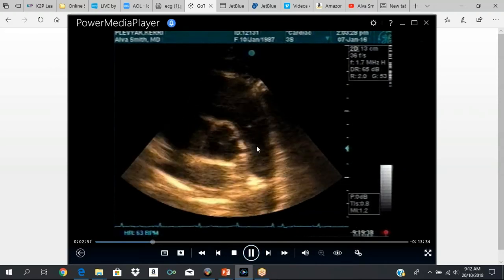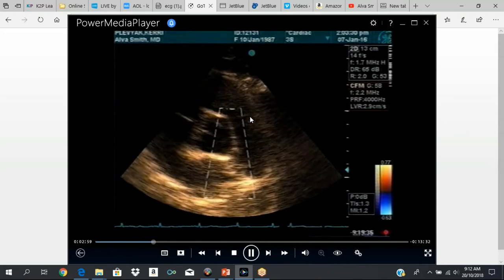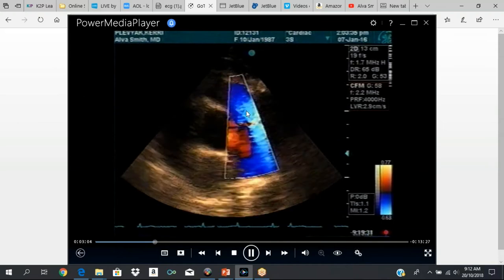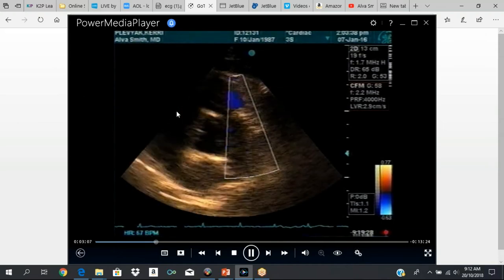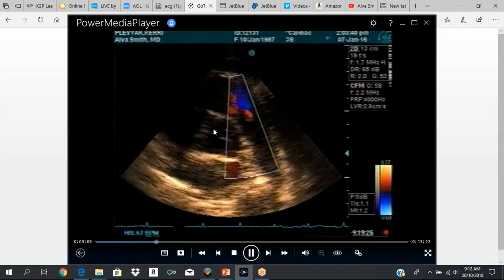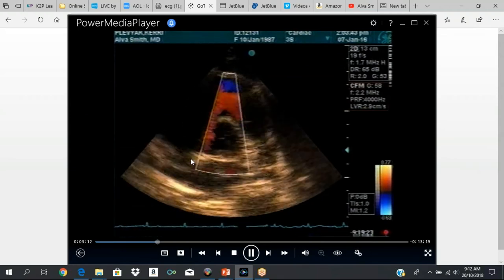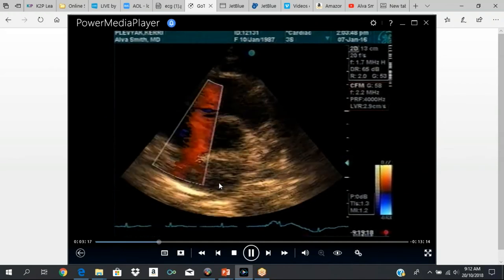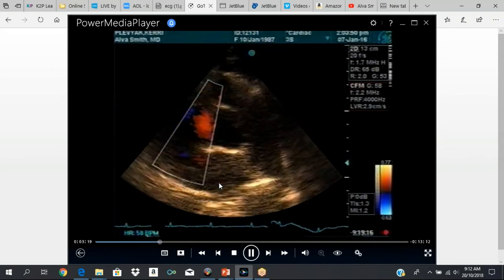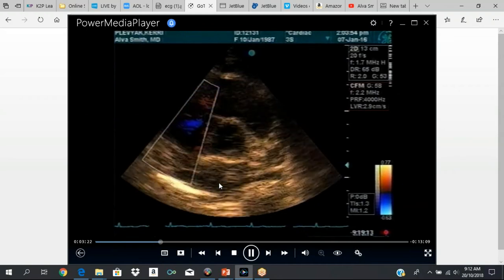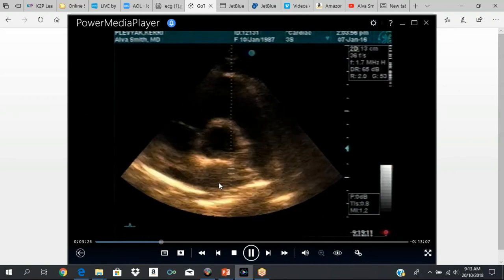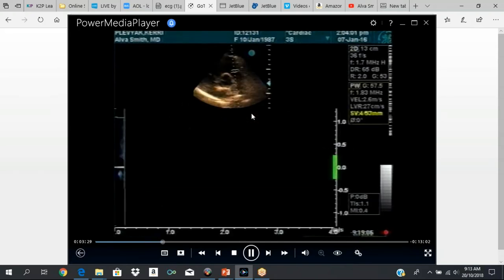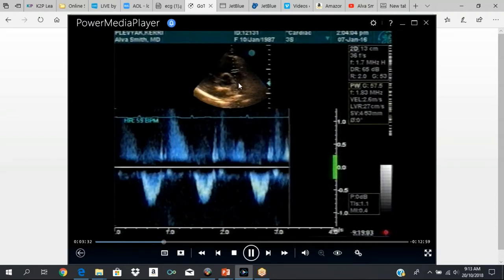Put it in play. You can see the pulmonary valve opening and closing. We'll ignore the Doppler for the time being. The pulmonary valve opening and closing, tricuspid valve over here, aorta with the aortic valve in place. This is your atrial septum, right atrium, and left atrium. The main pulmonary trunk is right there.